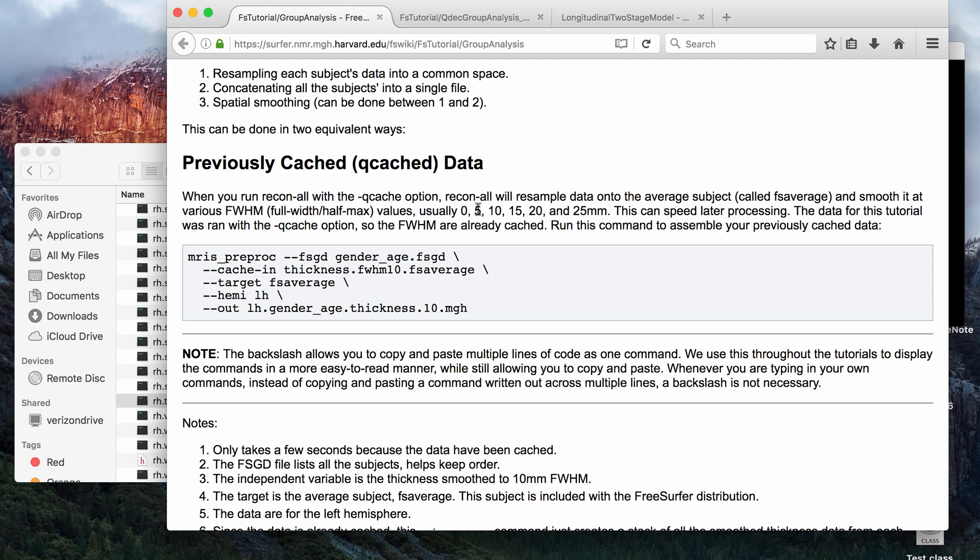It will smooth at 0, 5, 10, 15, 20, and 25 millimeters. It will smooth and then it will map the surface data to fsaverage, which is a FreeSurfer average brain.